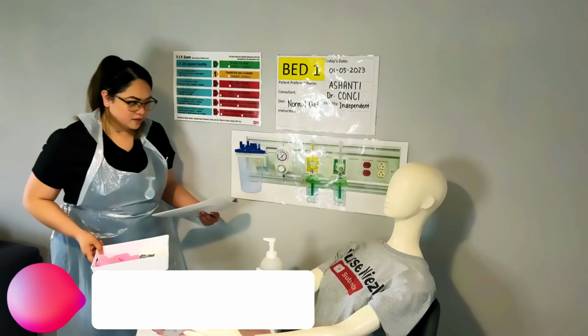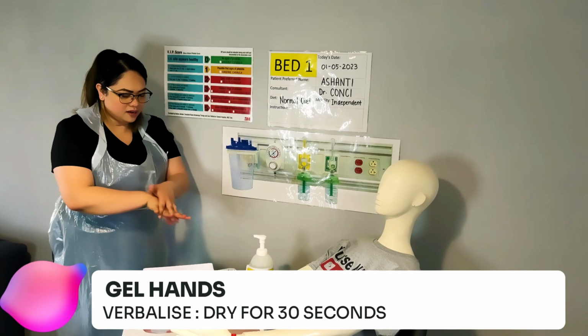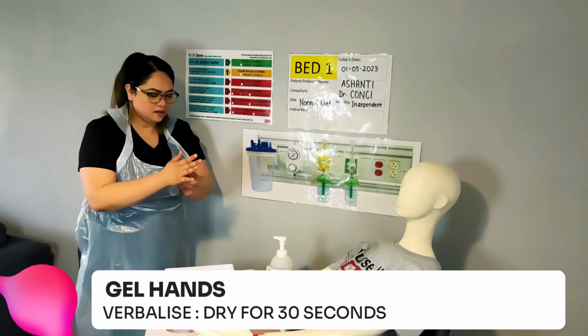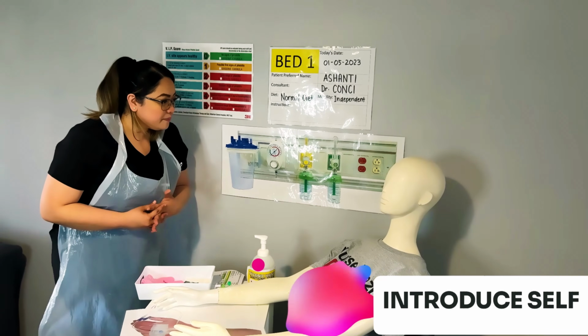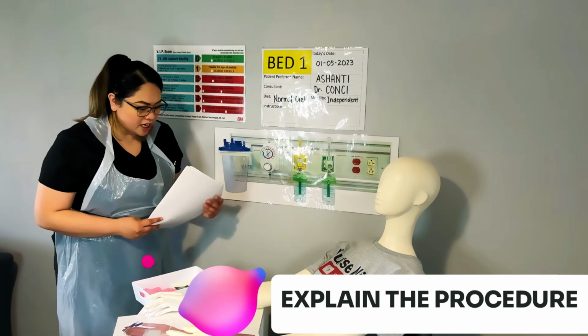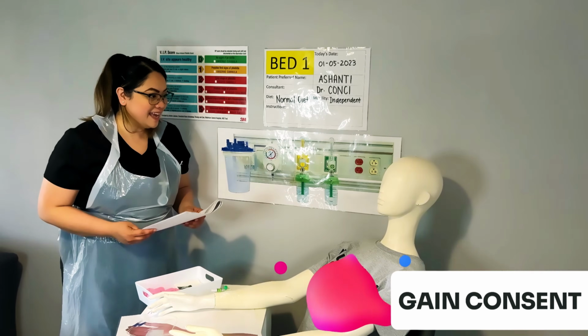Hello! So, let me just gel my hands. Hi, I'm Nurse Niezl. How are you? Are you alright? I'm okay. And I'm here because I need to do a VIP assessment and IV flushing on your IV cannula. Is that okay? Yes.